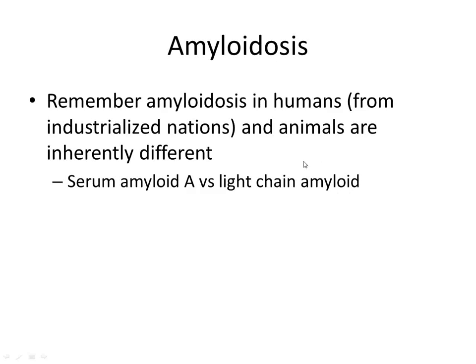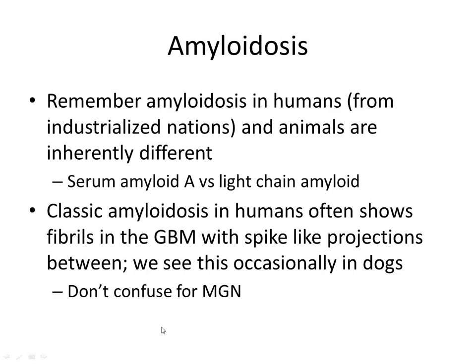So in those situations, you actually will see significant glomerular staining on your immunofluorescence, and it would be for your kappa chains or your lambda light chains. So IF can be very helpful in humans with light chain amyloidosis, whereas we don't see that in dogs or cats. I have not seen it yet in our biopsy service. Everything we've seen has been that blush staining that George mentioned, and so those are more likely to be serum amyloid A.